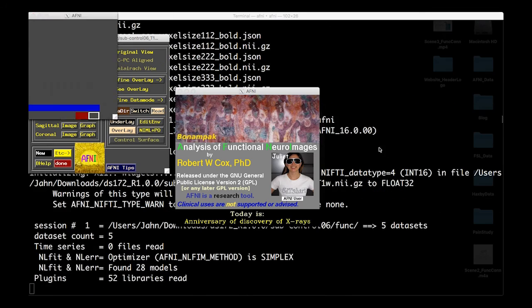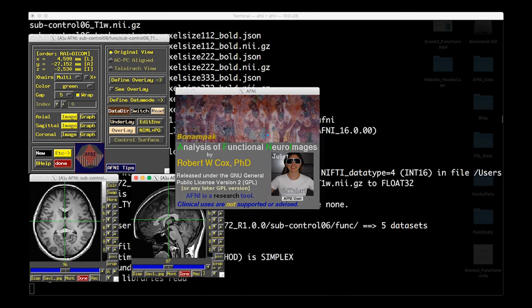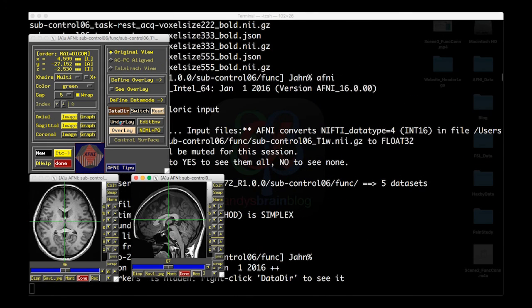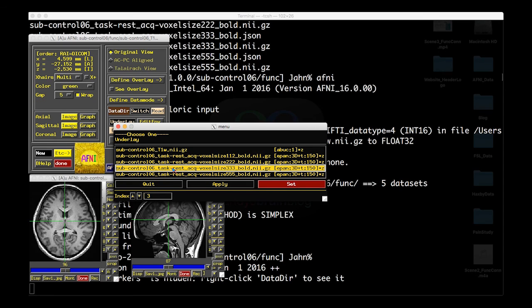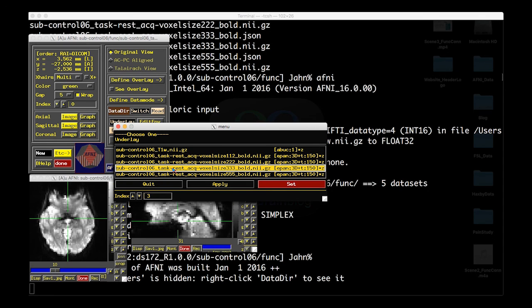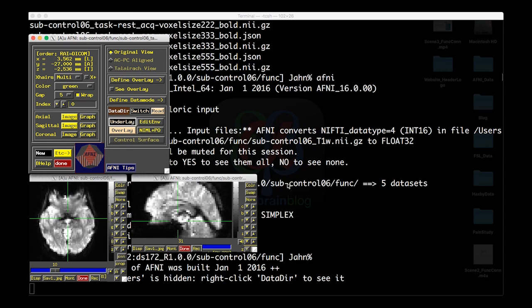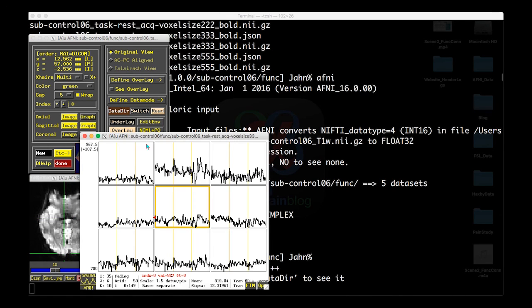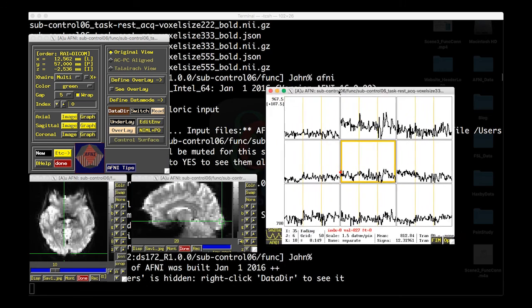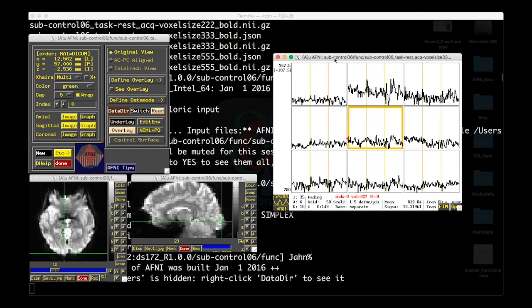Now, I want to give you some idea about what we're going to be looking at here, and what functional connectivity actually does. So if I set my underlay to my 3x3x3 data set, and I click in a voxel, say in the visual cortex, and I click on graph, that'll show the time series at that particular voxel.